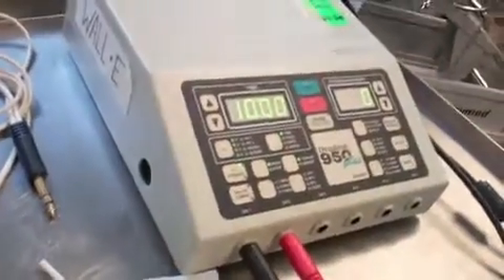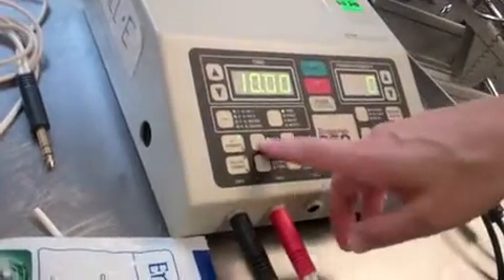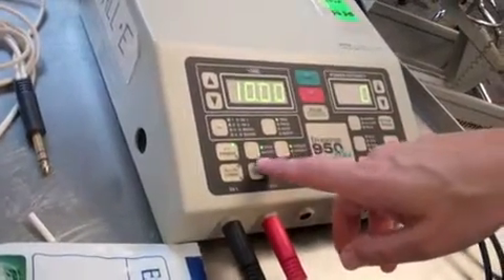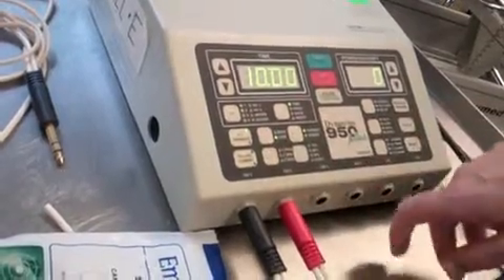On our machine, we push IFC. There's an automatic setup that comes up — we get an automatic ten minutes. This button right here tells us our frequency. It will automatically go to high, which we need a high frequency for sensory.